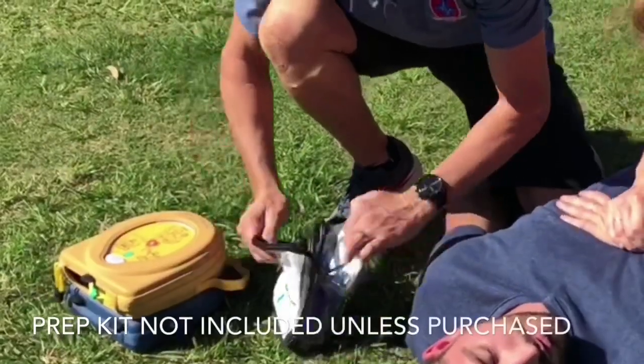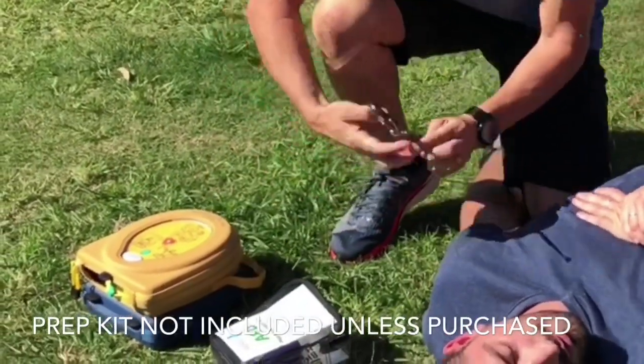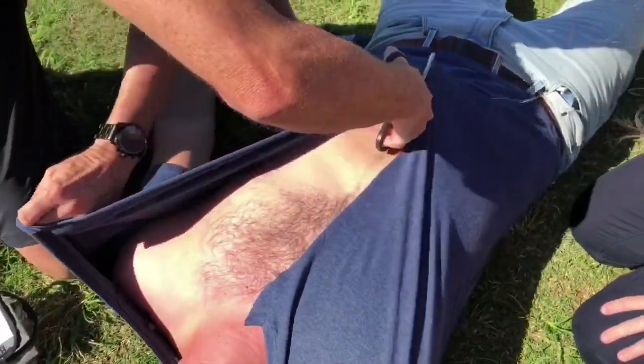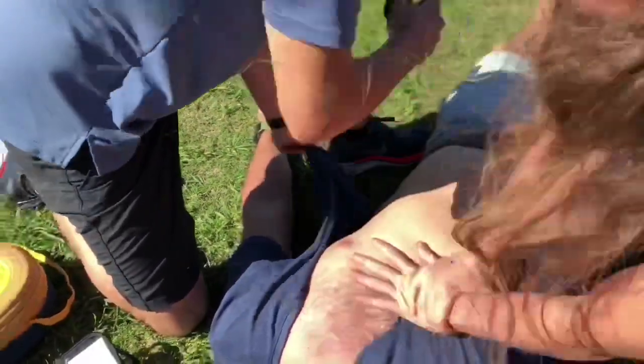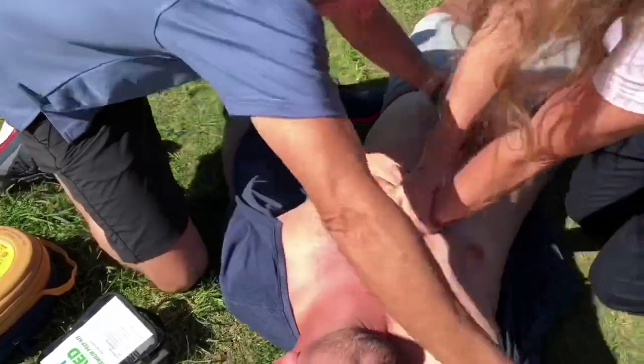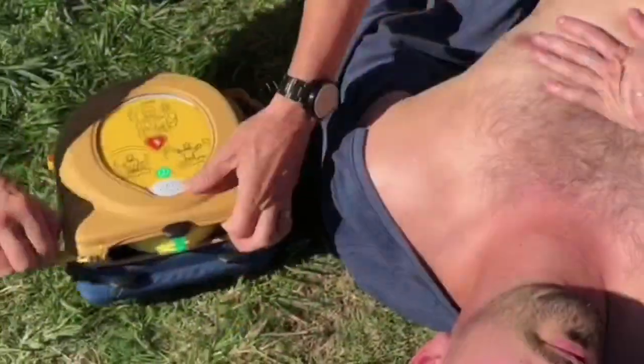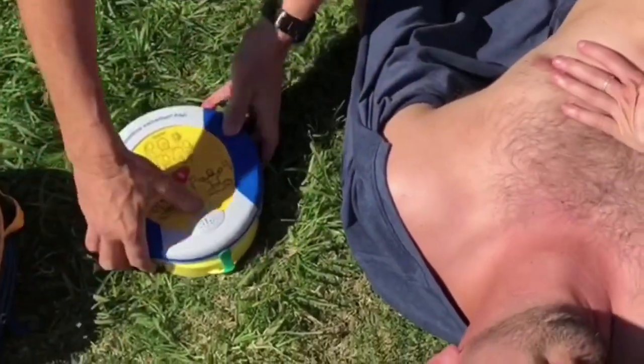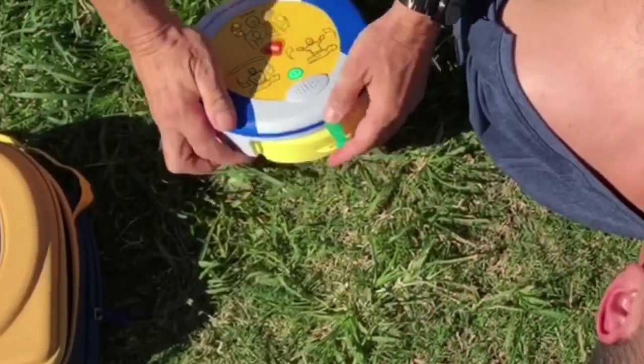In the back of the carry case of the defibrillator, you'll find a patient prep kit. There will be a pair of shears. Simply take them out and remove any clothing, which includes bras, t-shirts, or any swimwear on the top part of the chest. Once that's been achieved, take the defibrillator out of the pack, turn it on, and follow the voice prompts.